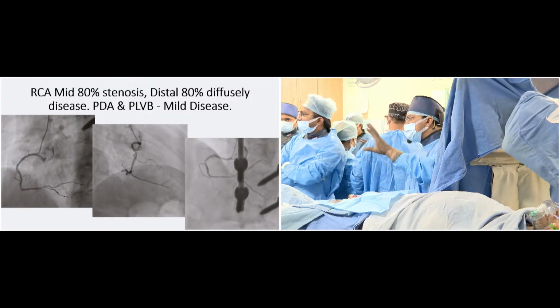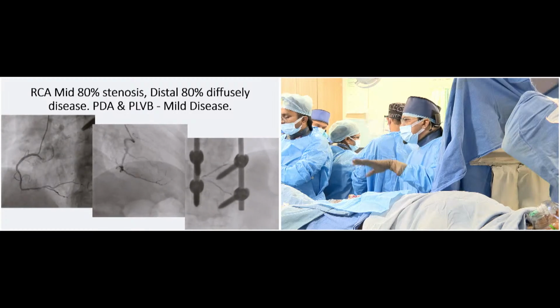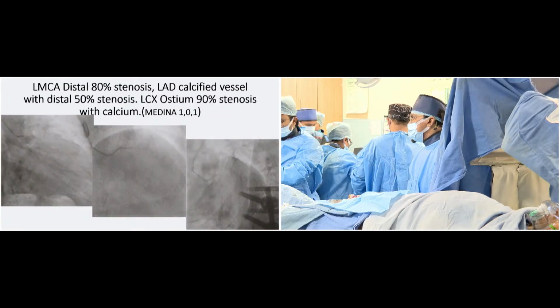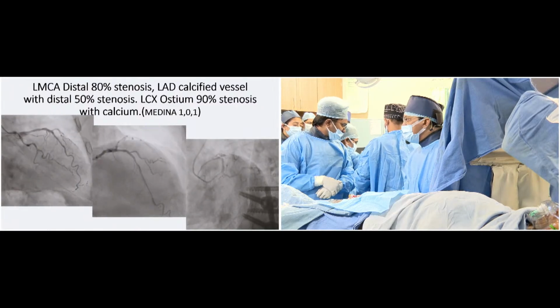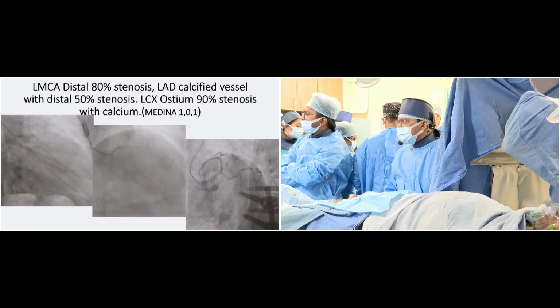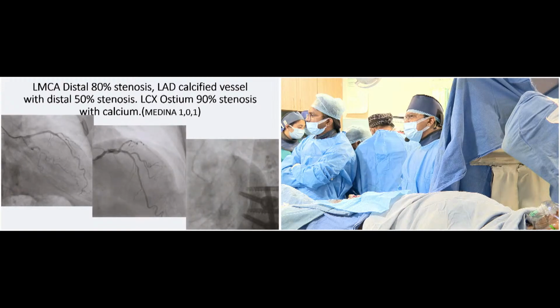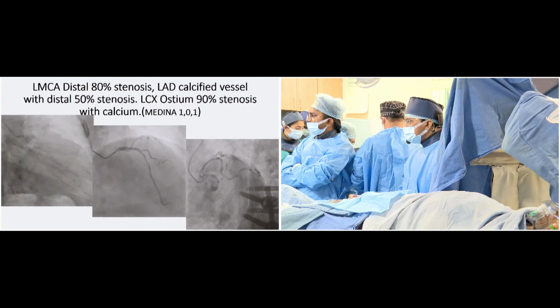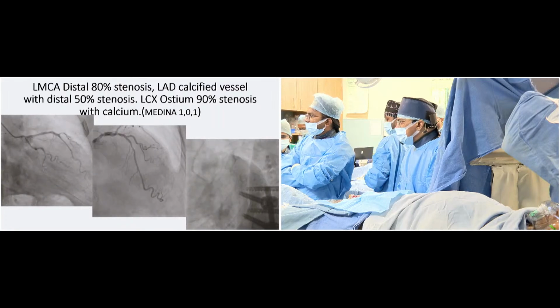And this is a very crucial area. Why? Because if the left main closes, almost two-thirds of the LV is gone. So the chances of LV dysfunction, future cardiac failure, or sudden cardiogenic shock onset are very high. That is the reason, don't compromise when you do the left main. In the left main, you should have an optimal result. Choose the best technology. That is the reason here we are taking the imaging, MLD max.